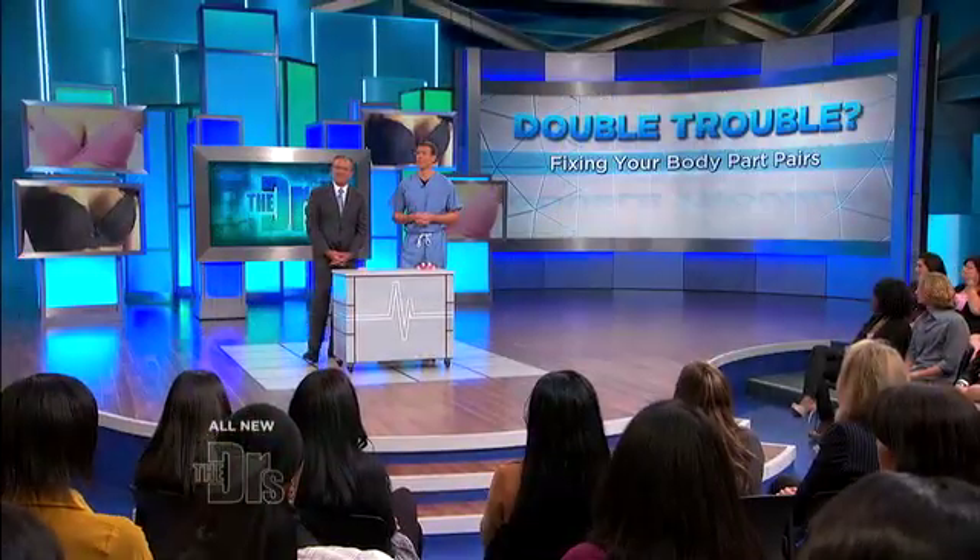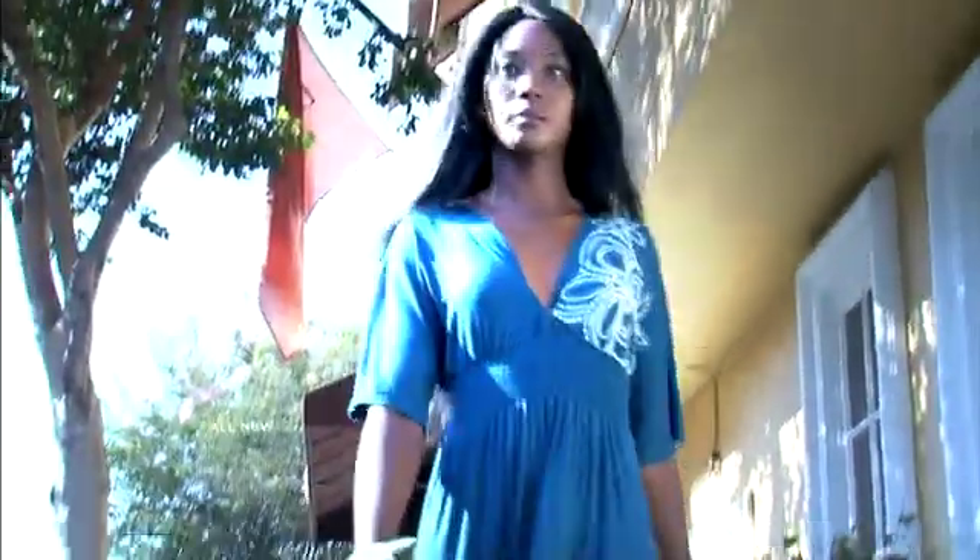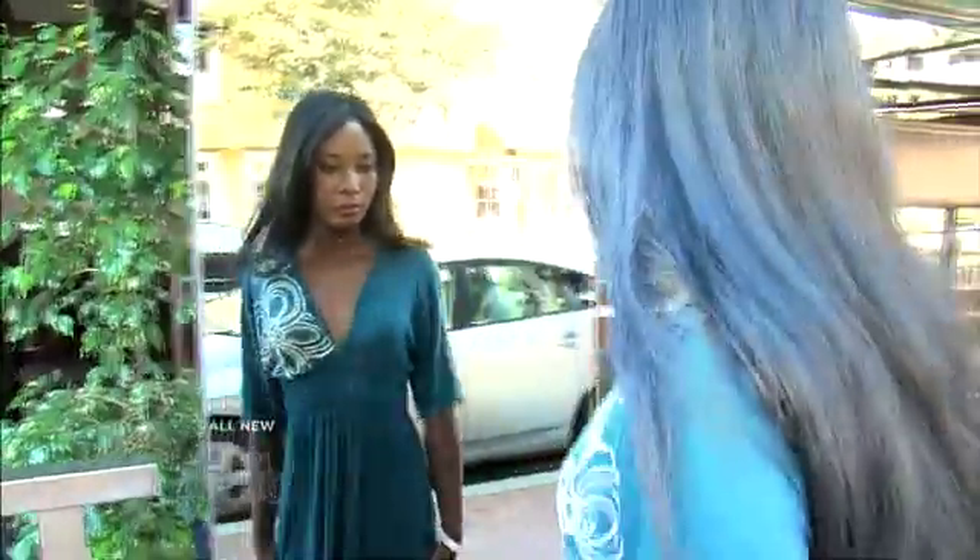No breast problem is double trouble for Dr. Ordon here. He found a custom solution for Melissa. I'm doing primary breast augmentation on Melissa. She is ideal for this new highest profile implant put out by the Mentor Corporation. She has a narrow chest configuration, a narrow natural base diameter to her breasts, and she's looking for that more projecting, perky look.